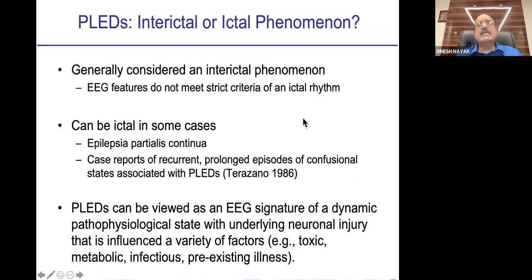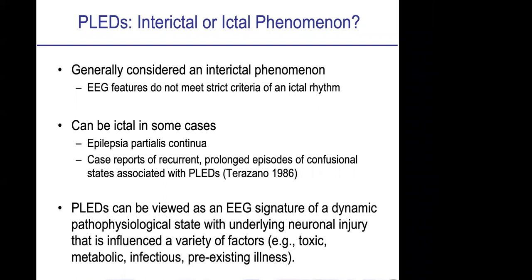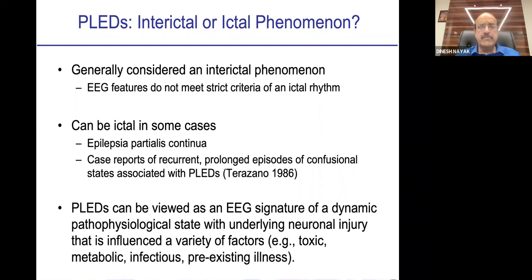So is PLEDs an interictal or an ictal phenomenon? At the moment, it is considered an interictal phenomenon. That is very important. Very rarely you call it an ictal rhythm. Predominantly, it is still considered an interictal phenomenon.